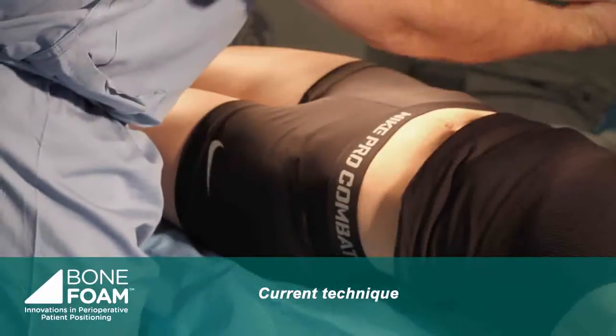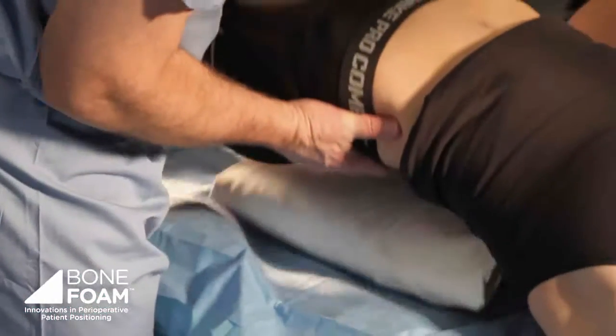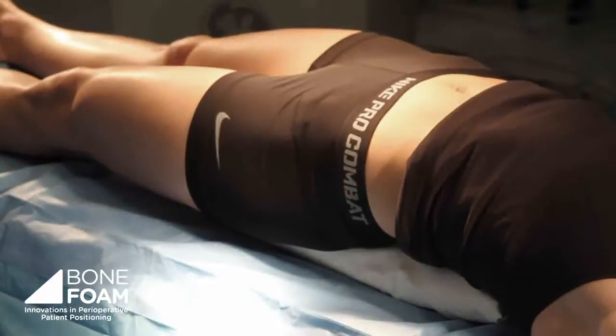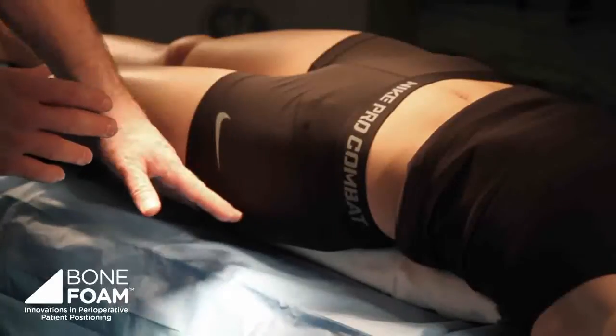Traditionally, what we did is fold up some sheets, like so, and prop them under the patient's sacrum. One of the challenges is that this technique has often caused the patient to be somewhat floppy because they can rock during the case and change position, and it's typically unstable.